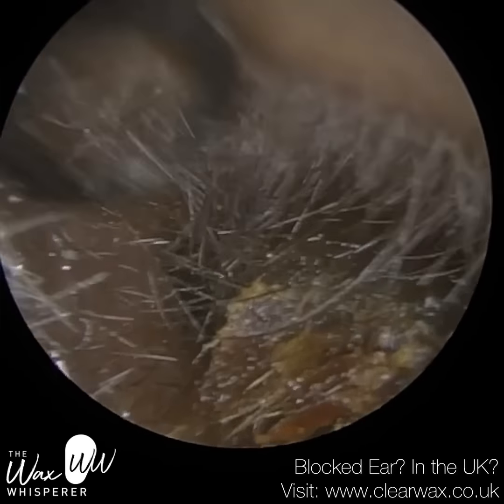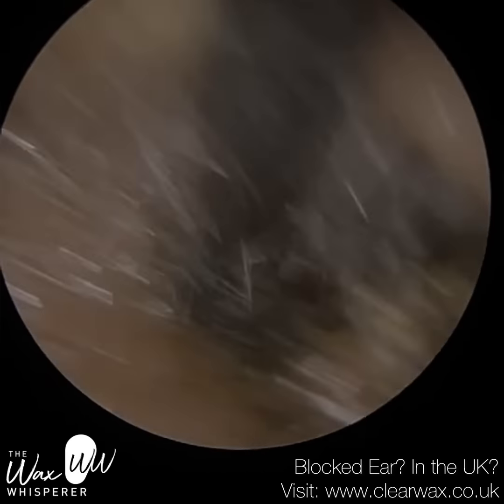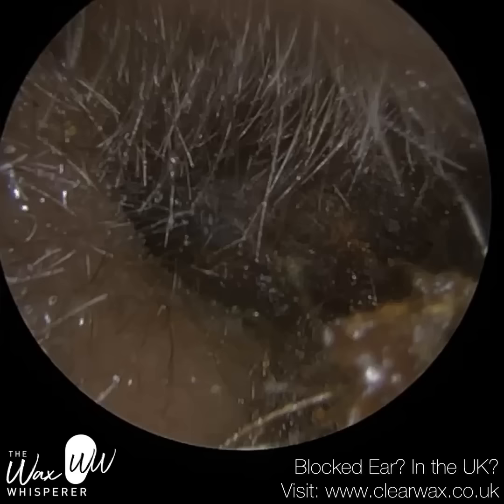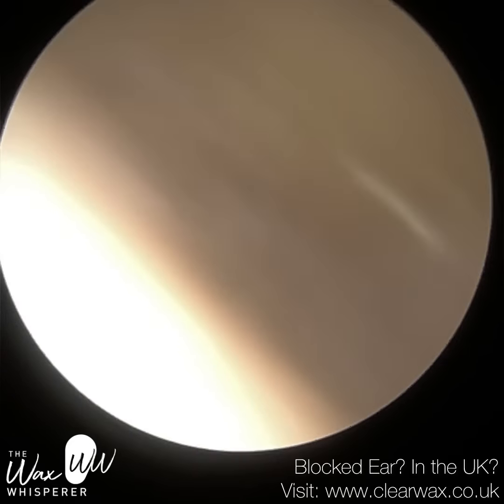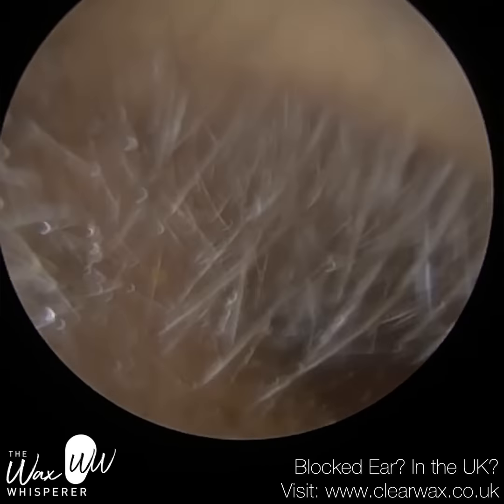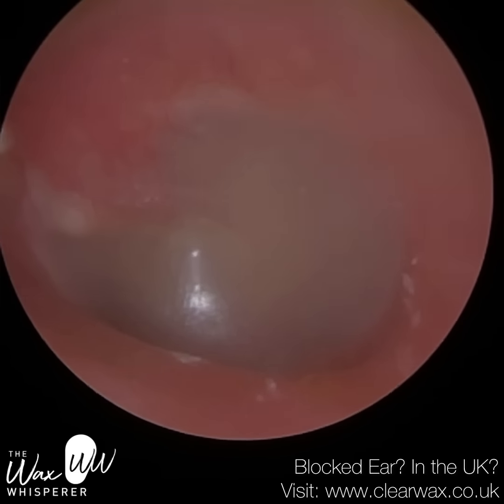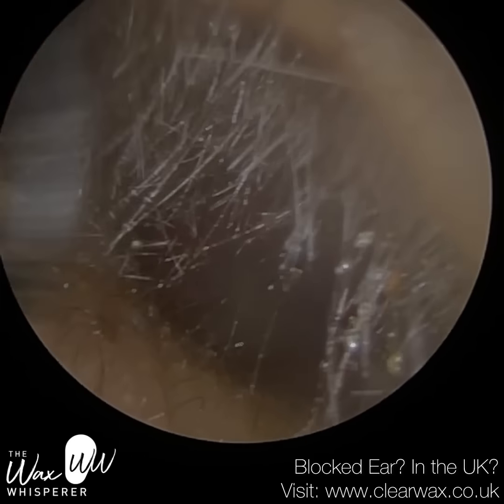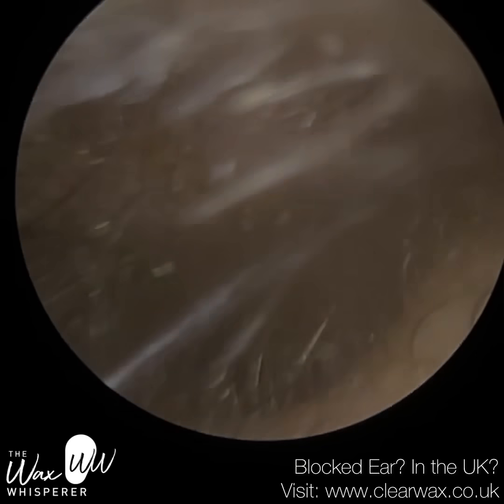I've managed to lift it off the floor of the ear canal and angled the wax around the first bend, which is an S-shape — a sigmoid shape. I've orientated the wax so the tip of its surface is facing towards the entrance, then gone back in with the curette and managed to drag it out in a big piece. I don't think I took a still image on this occasion — sometimes in clinic it's just so busy you don't get the time. So the left ear was successfully treated.